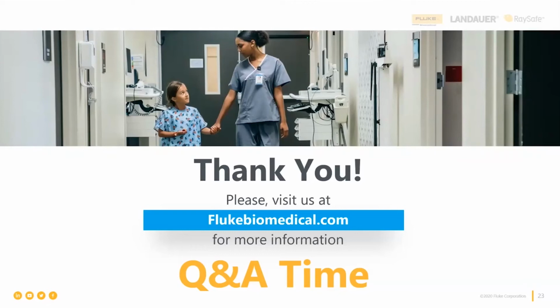Yep. So output energy testing, absolutely. The shock advisory, or what arrhythmias are allowed to be shocked or not allowed to be shocked, needs to be a function that is evaluated. So you need ECG simulation with the arrhythmias that are in concern. Does it have the right protocol in it? Is it using today's version of the American Heart Association or Red Cross? Which protocol is programmed into it, and is it the modern one? That might need to be updated. That goes to the firmware of the AED.